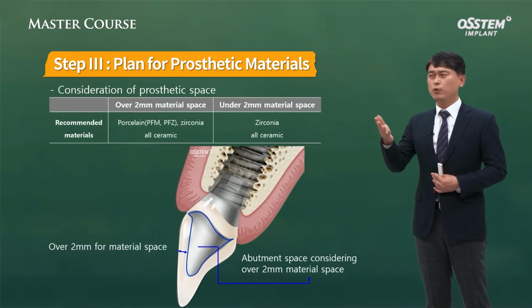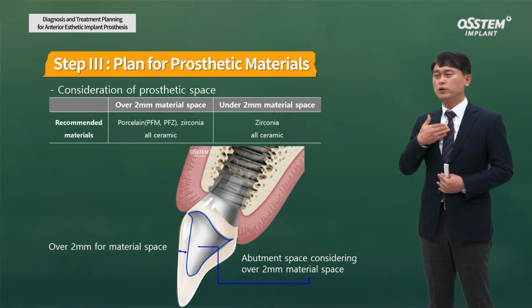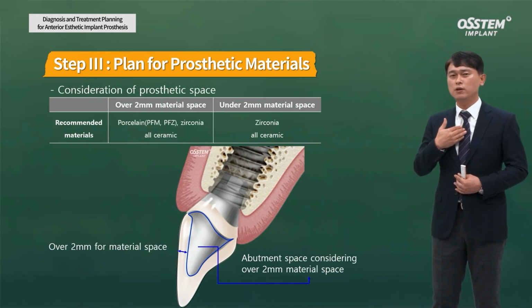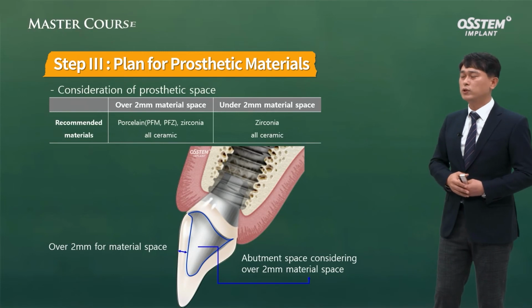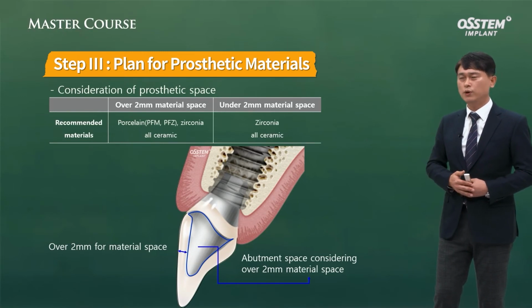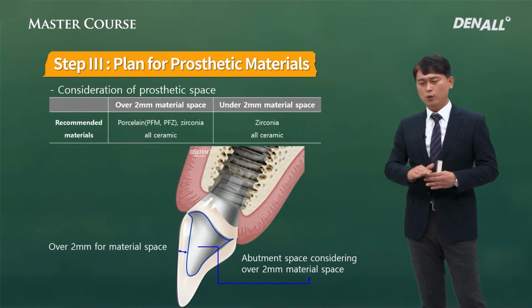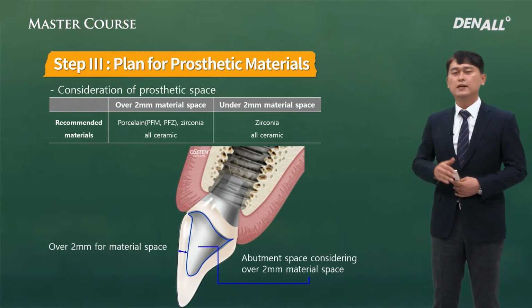There are so many complicated things to talk about in terms of material. I normally use monolithic zirconia in my clinical practice. I do not use veneer these days because we have great gradation block or multi-layer blocks, and you can use zirconia for anterior restoration as well. If you use opaque treatment, you can prevent titanium being shown through.